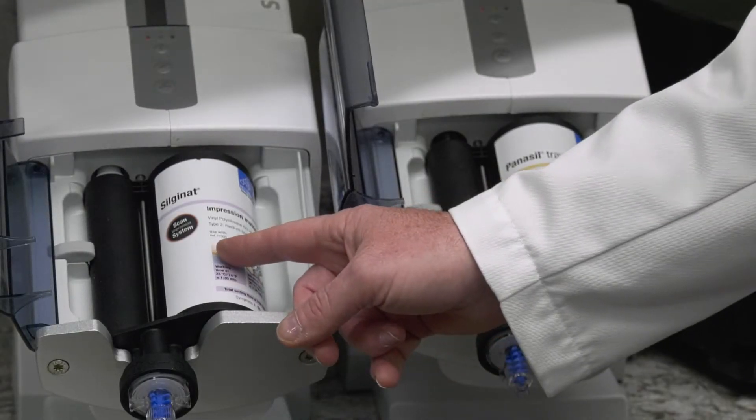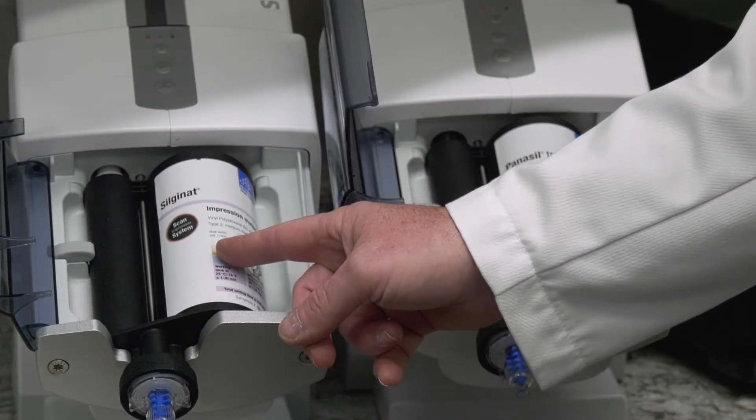Now for an alginate substitute, we use a product called Silginate — that's also from Kettenbach. That material is quite a bit less expensive than the heavy body material, it sets much quicker, and you can use it for your preliminary and final impressions for your dentures.